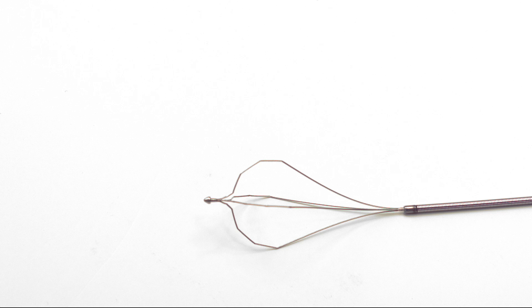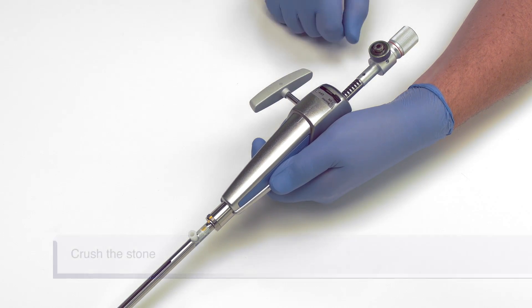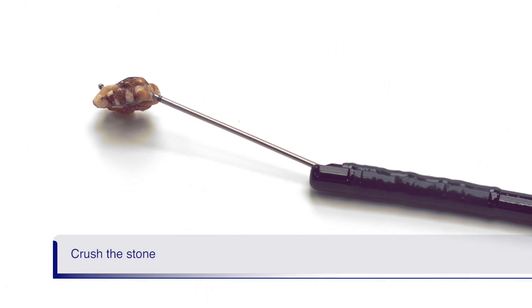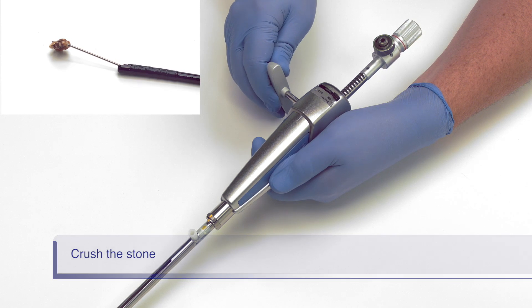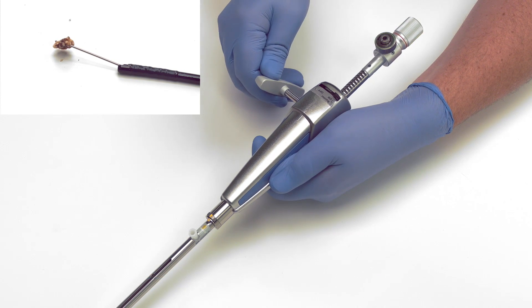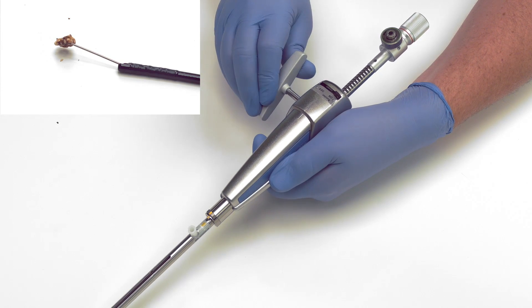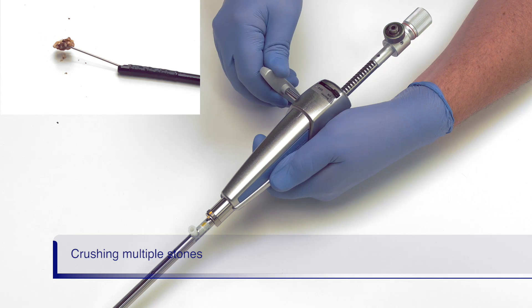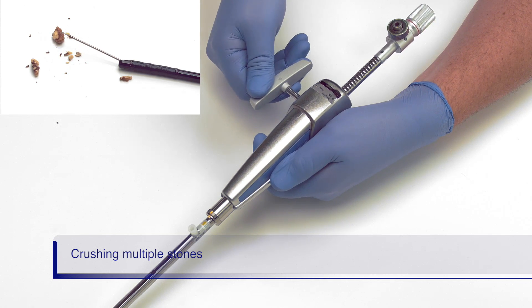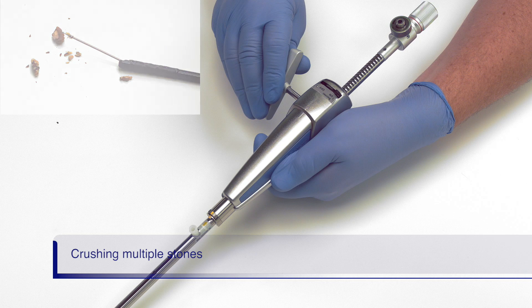Now we can crush the stone. Push the ratchet switch into the ON position. Slowly turn the handle to close the basket around the stone and eventually crush the stone. It is important to turn no faster than shown here, or the stone can slip out of the basket. Lithicrush V can be used to crush multiple stones; however, you will need to crush each stone one at a time.